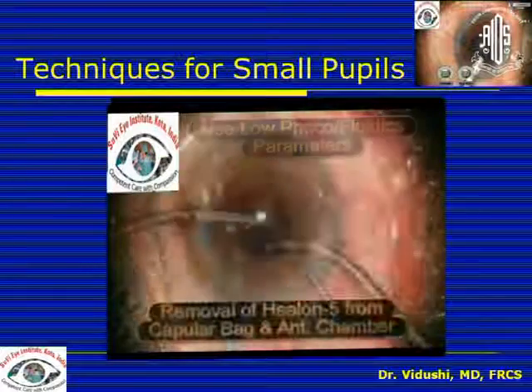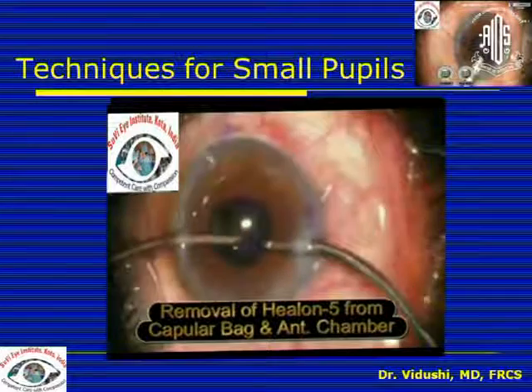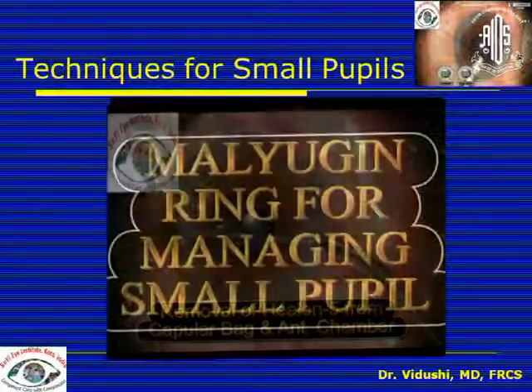Do a slow motion FACO emulsification and always remember to remove all the viscoelastic from under the IOL, because these are high viscosity viscoelastics which create a propensity for IOP rise.